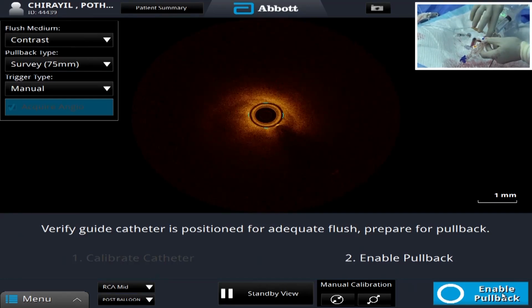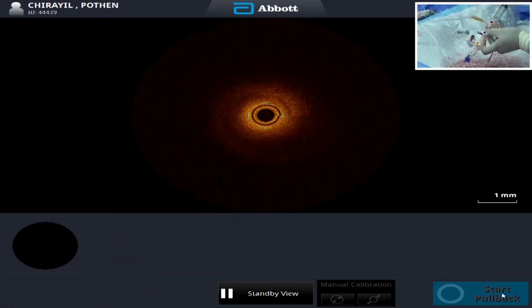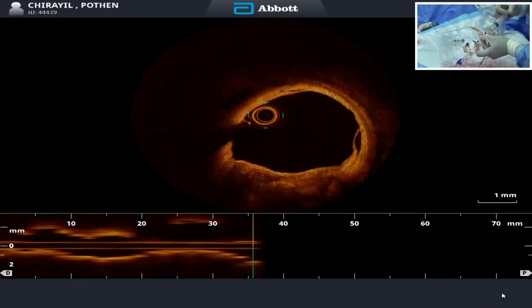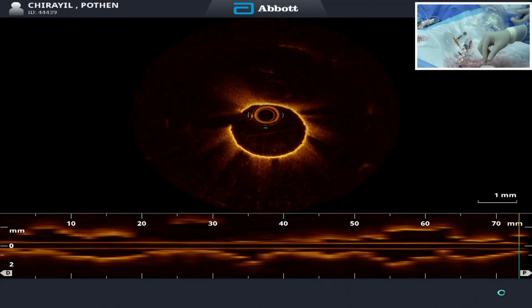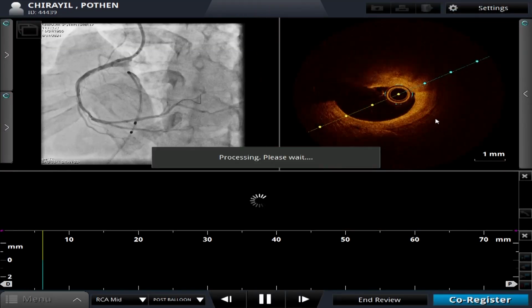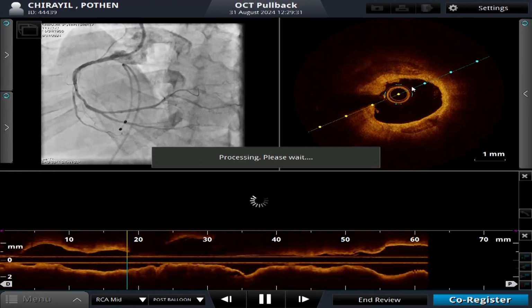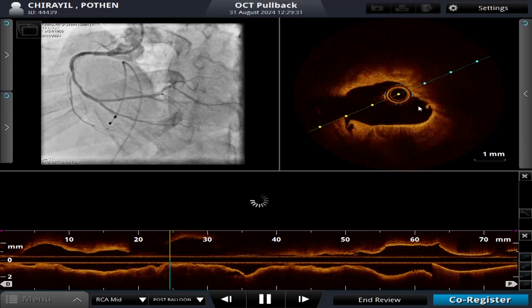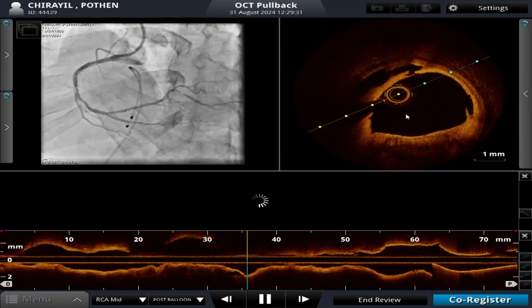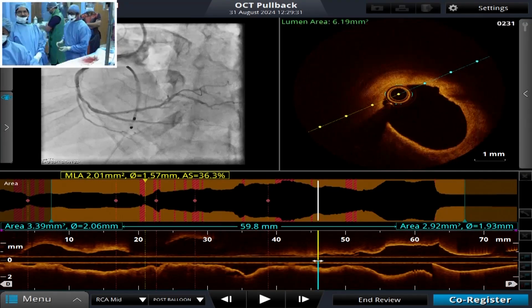Okay, you can do that. Activate. Now give the stent. Yes, a dissection is produced. Meanwhile, we'll see the image, sir. We'll go with the stent.